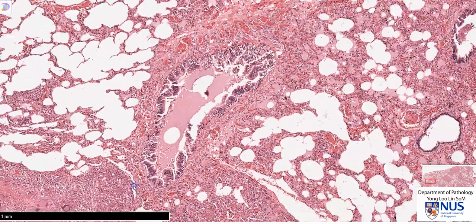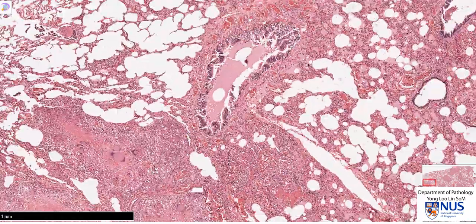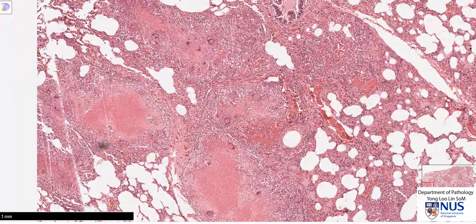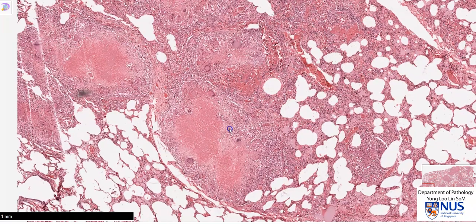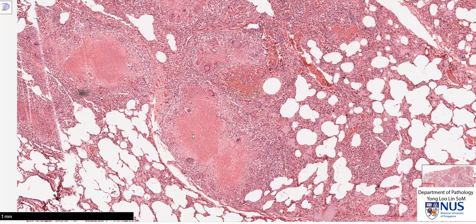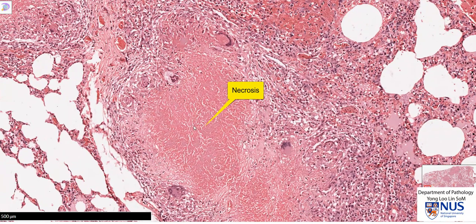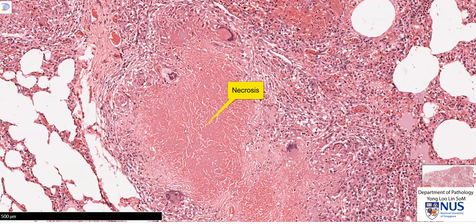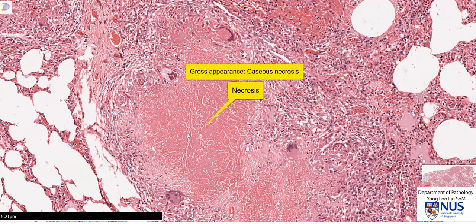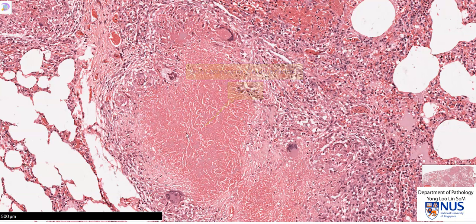Moving over to the area adjacent to it, we can see there are some funny looking areas with a central pink region. This pink region represents necrosis — what we are seeing is a very amorphous appearing eosinophilic material. Grossly, this would look whitish and very crumbly, and it will kind of resemble cheese. Hence, it's called caseous necrosis, based on the gross appearance.